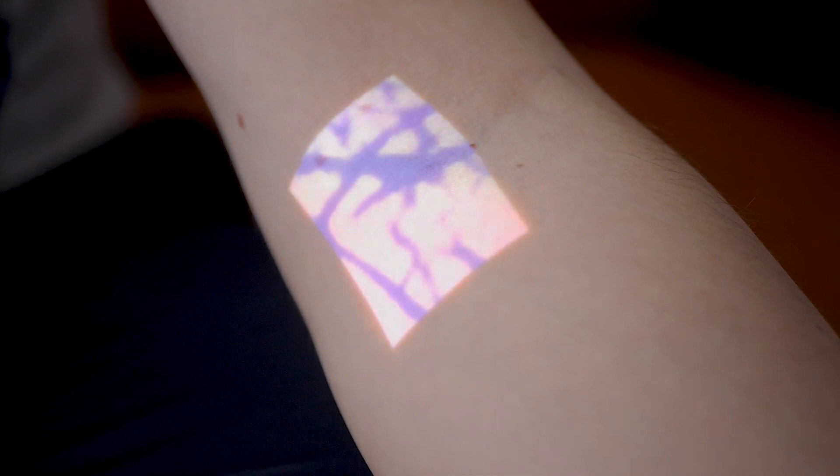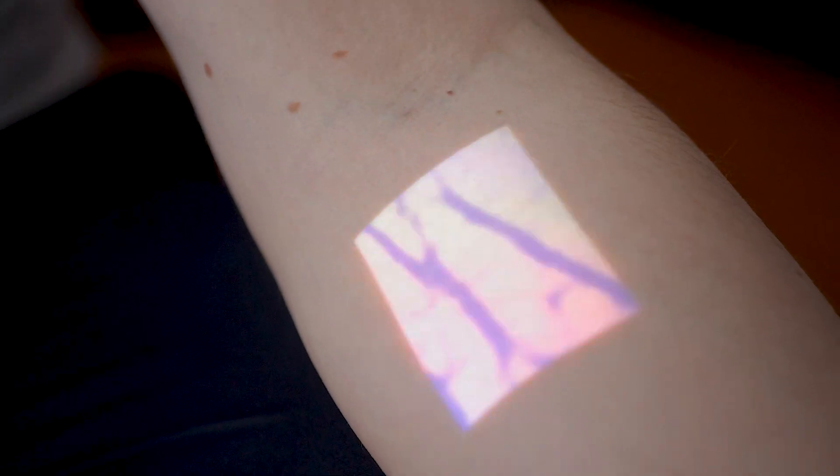And then magic is going to happen. Actually, based on the description in the user manual, before the first try I have to make sure the device is working in an optimal way. You can see that every single square must contain a patch — and it means the device is working properly. Fortunately, I haven't made any mistakes about it yet.